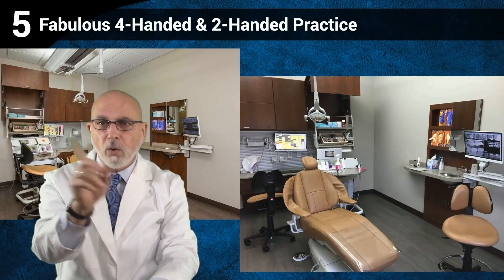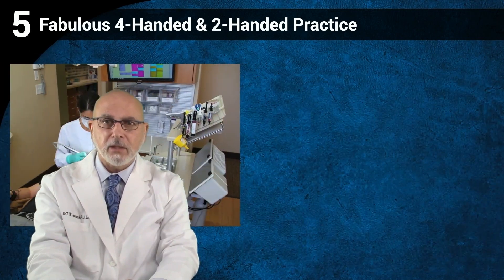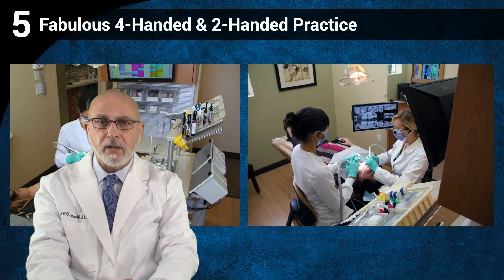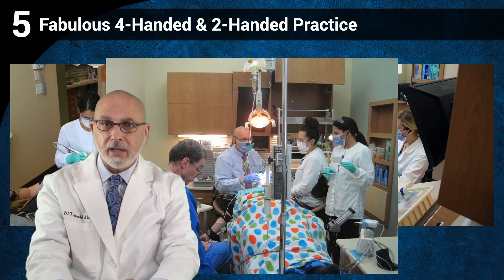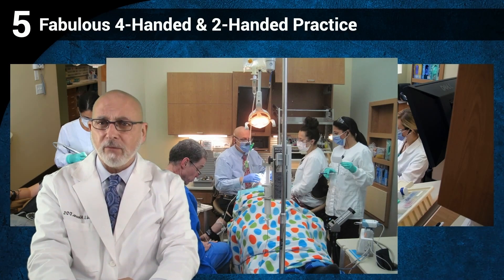Whether you need to convert to a more rear-bias setup, it's totally possible to do that. You should be able to have forehand, two-hand, all seamlessly happening — and if you need six or eight hands, like in a sedation situation, you should be able to cover that without effort as well.